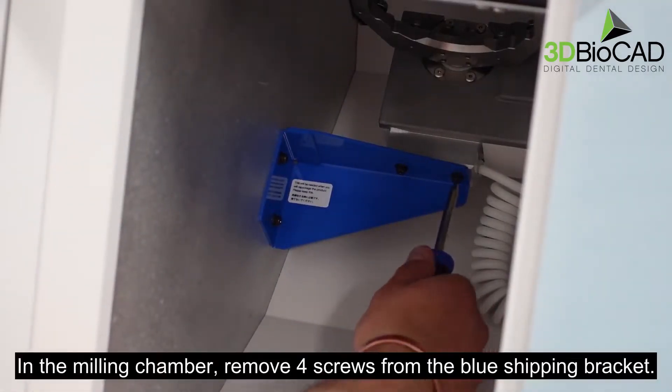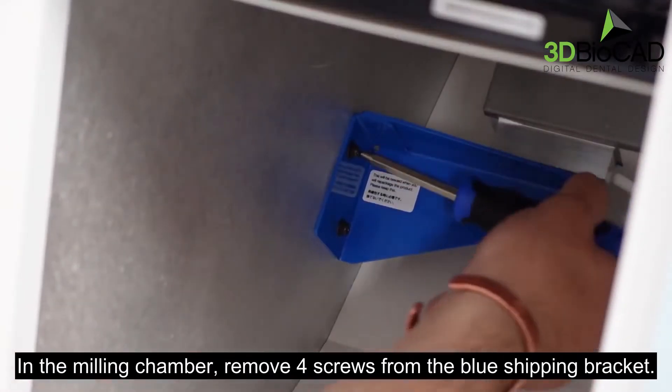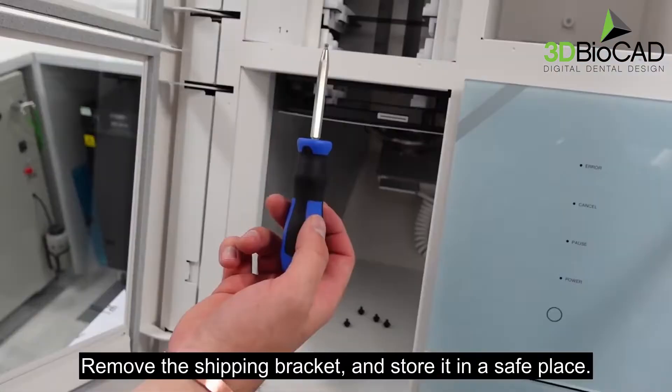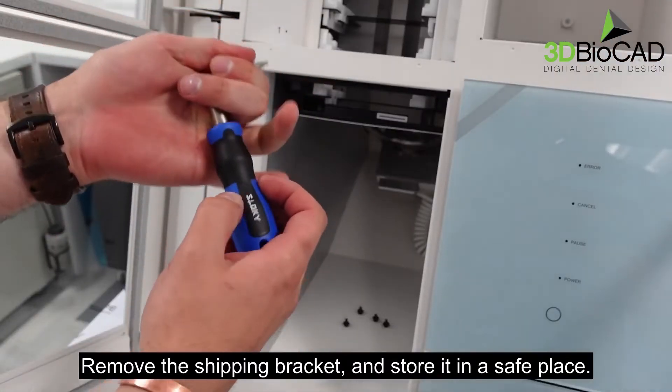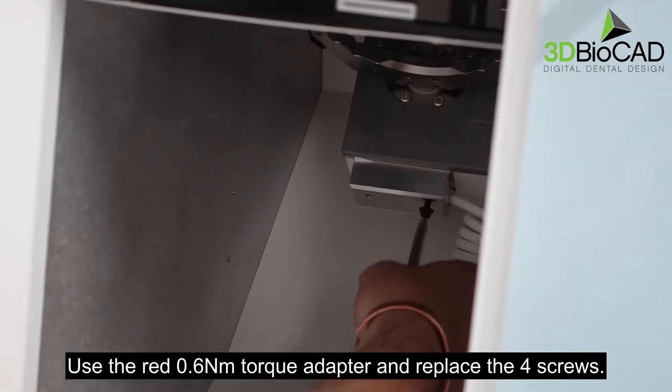In the milling chamber, remove four screws from the blue shipping bracket. Remove the shipping bracket and store it in a safe place. Use the red 0.6 Nm torque adapter and replace the four screws.